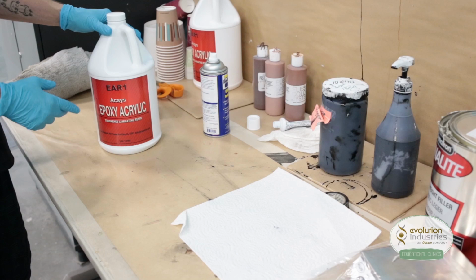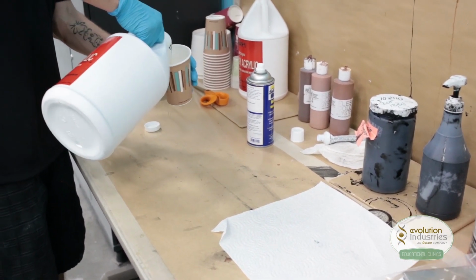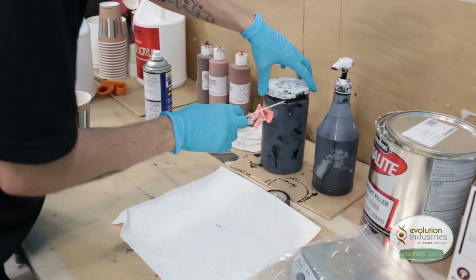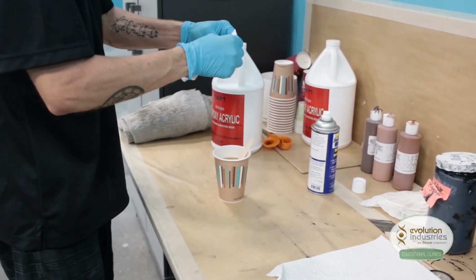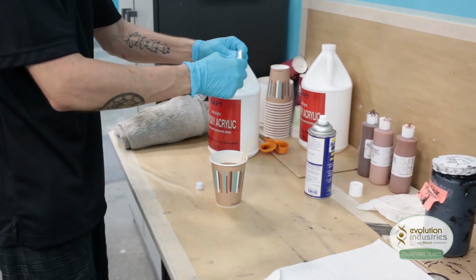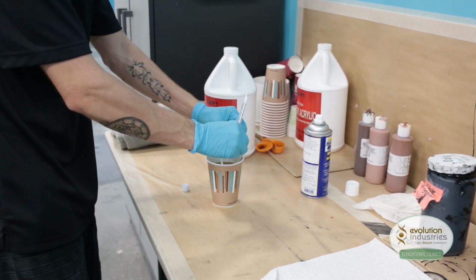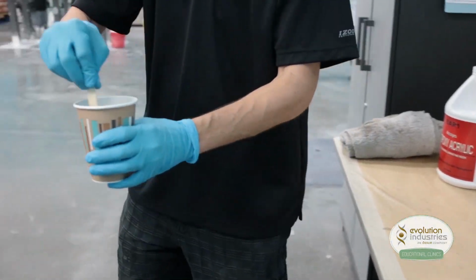Here at Evolution, we use an epoxyacryl resin. So for a carbon fiber finish, we'll use our resin and just a small dab of black pigment. And with the cream hardener, now with the black pigment, you have to be a little careful because it will accelerate the setting time. And we'll mix it up and pour it in.